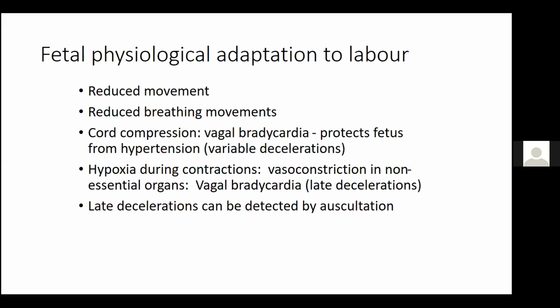So in Dublin, for example, they don't use CTGs. They only have midwives that listen to the heart rate of the baby after a contraction. And it will sound like this: doom, doom, doom, doom, doom. So that is the late decelerations. After a contraction has ended and ceased, you still continue to get a slowing of the heart rate, which then may increase after a while back to where it started.